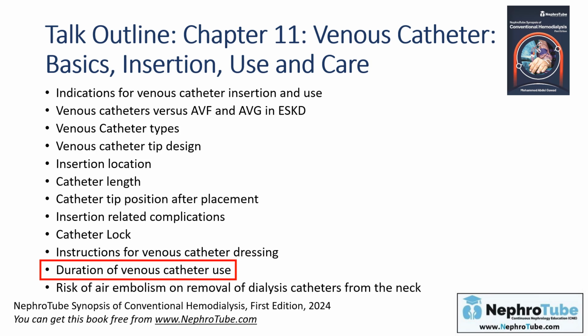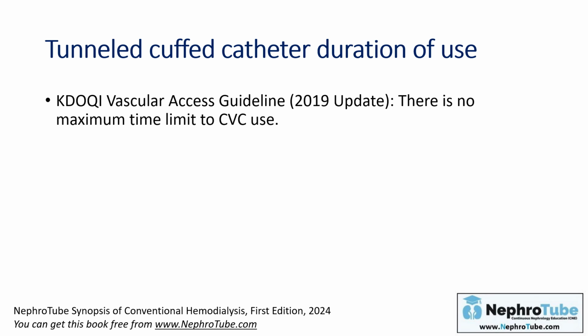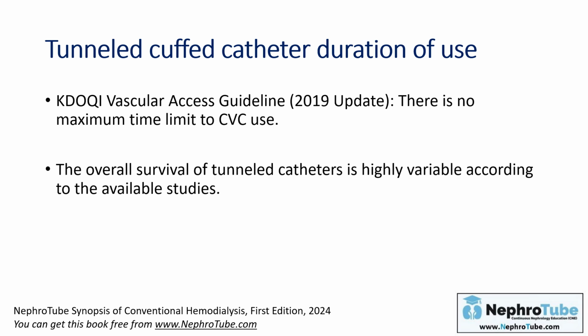Then, what about the duration of catheter use? For how long can the catheter be kept in place? Regarding tunneled cuffed catheters, KDOQI mentioned that there is no maximum time limit, and it is reasonable to use these catheters as long as they are functioning. The overall survival of these tunneled catheters is highly variable, by the way, according to different studies.